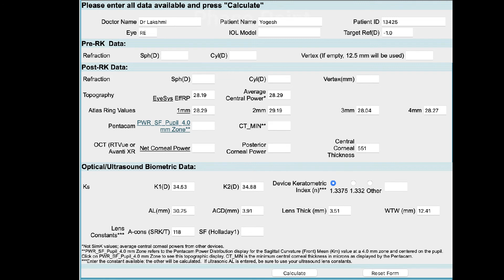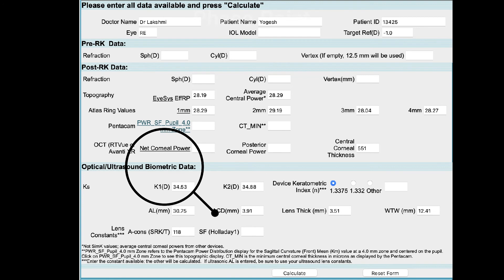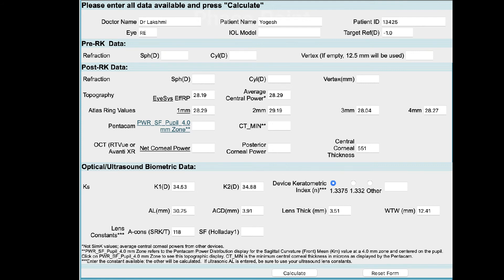We now come to biometry. The gold standard, needless to say, would be optical biometry. If you have no access to an optical biometer and cannot outsource it, you can fill in data from your A-scan. If you do have access to an optical biometer, fill in all relevant data asked for. Then move to filling in the A constant of the IOL you plan to use, after which you hit calculate.